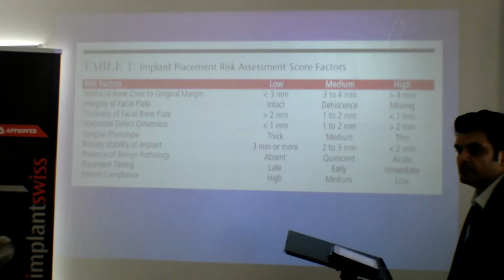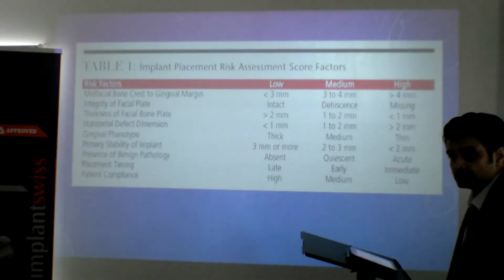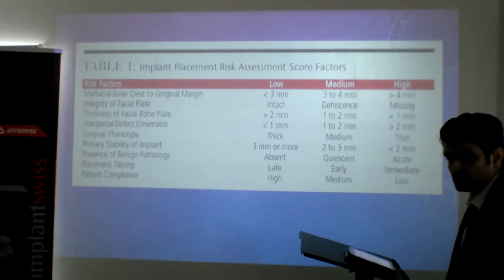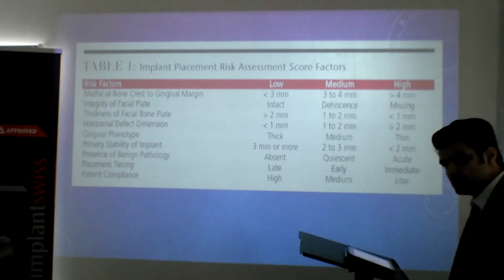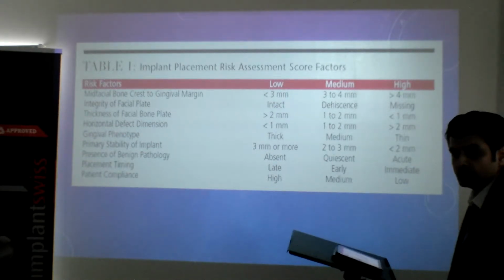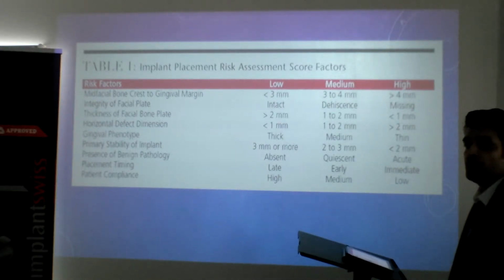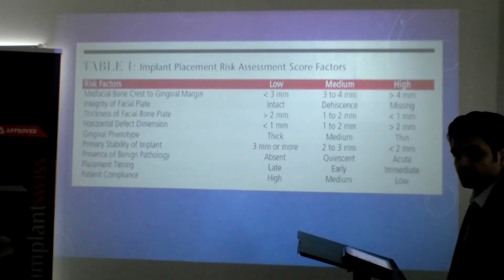That's how you can be planning. See, this is your initial photograph that you've taken. You may have used some calipers at that time as well, or a probe is good enough as long as the ridge does not have dehiscence in it, or you've not lost aggressive bone there. It will be fine. But if you have lost too much bone, then use the calipers.